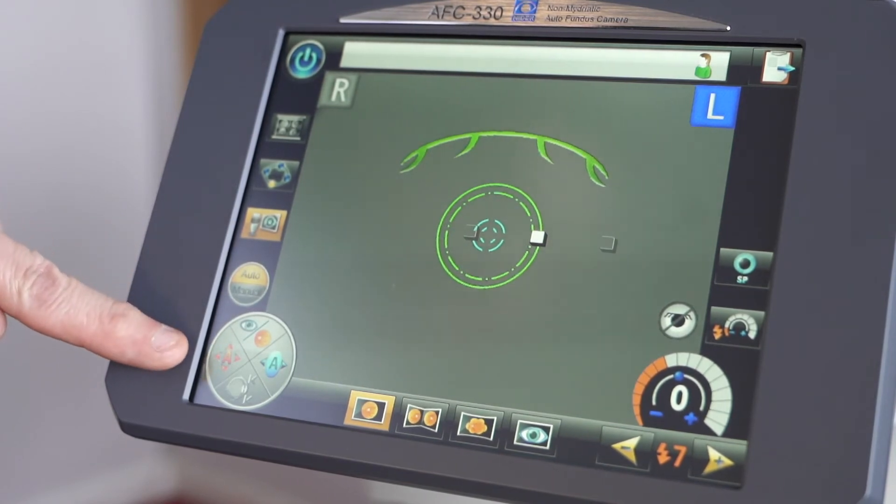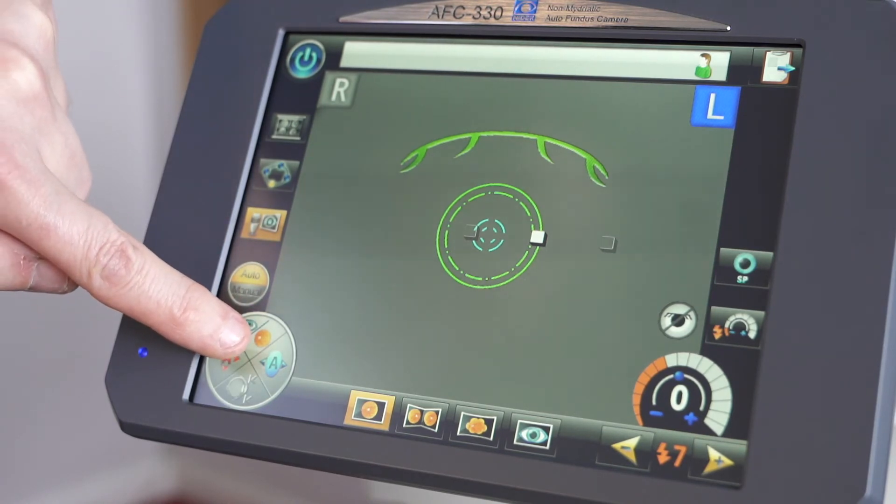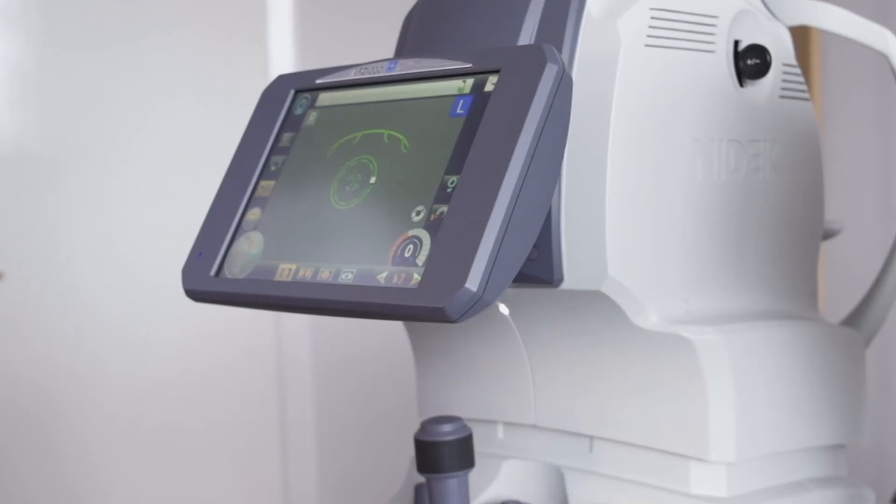Here we have a button to manually switch between auto and manual mode. And the icons down here are showing us that we have automatic tracking, automatic changing from anterior eye to fundus, automatic focus at the bottom.